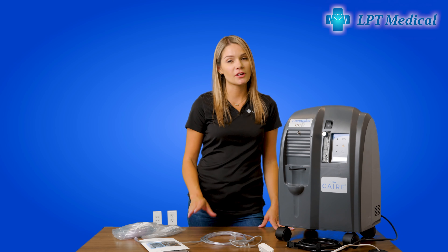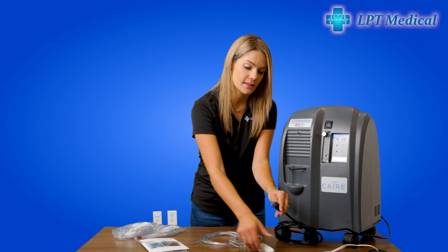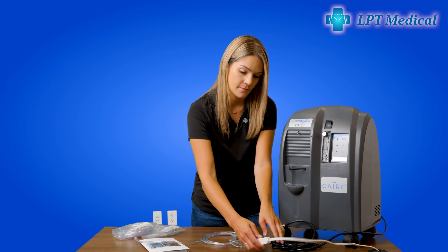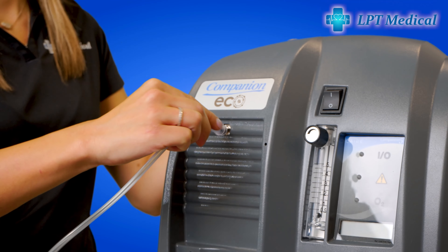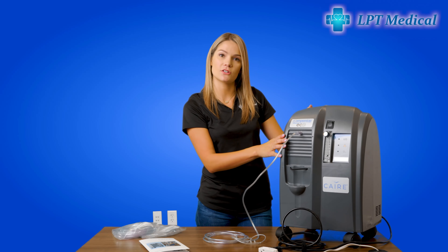Now I'm going to show you how to set up your Care Companion 5 for first-time use. The first thing we're going to do is plug in the unit and then attach your cannula, and now it's ready to be turned on.